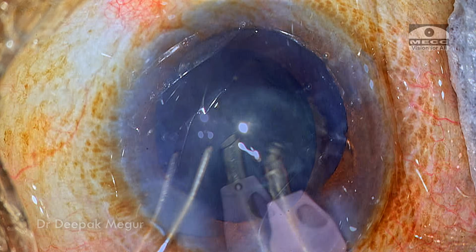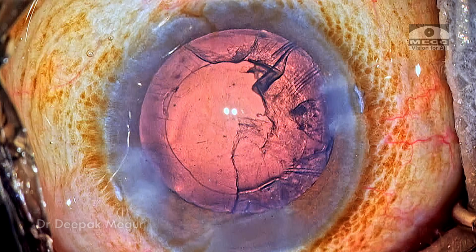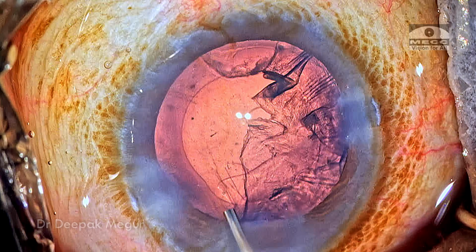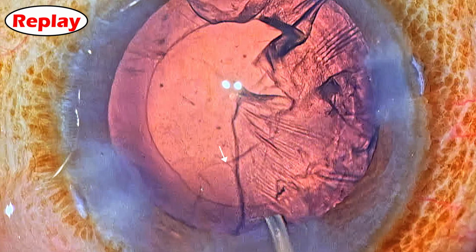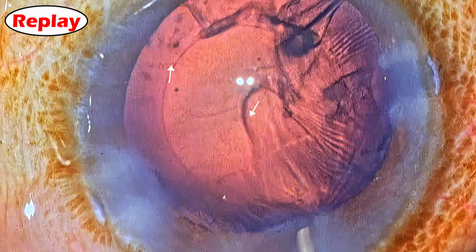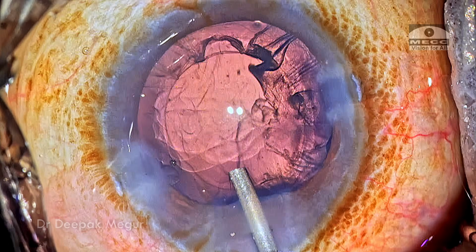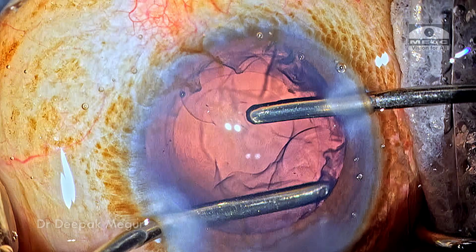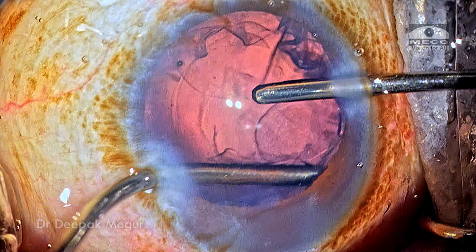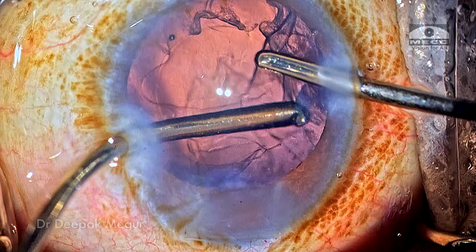So once the nucleus is emulsified, time to aspirate the cortex, and before that, as a routine, I flush the posterior capsule with BSS just to loosen some of the fibers which could be sticking onto it. I noticed that there is a wrinkling of the posterior capsule. Maybe it is marginally more than what I usually see, and I'm filling the bag with OVD. This is usually customary for me before I proceed with cortex aspiration, just to add a layer of safety. And as the first few cortical fibers are being aspirated, everything looks fine.